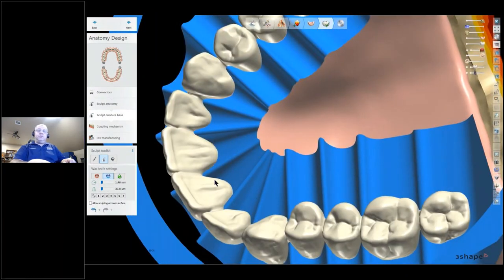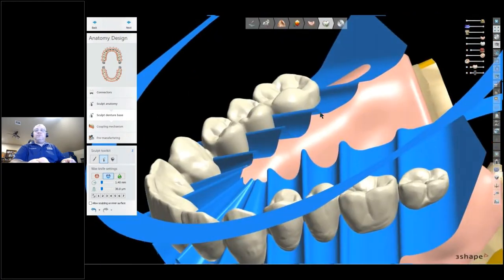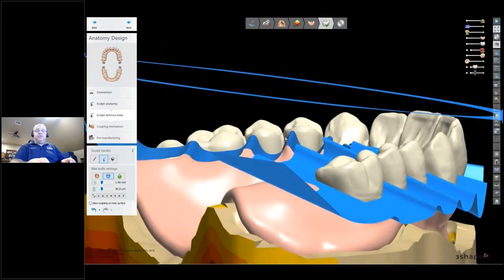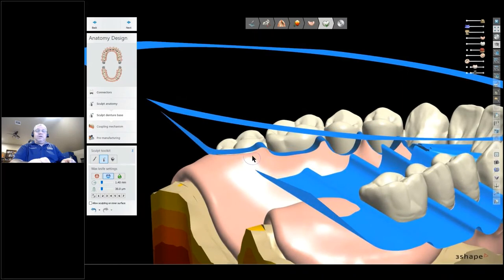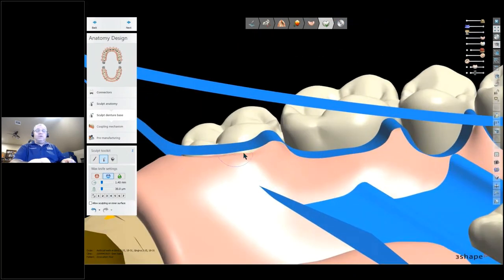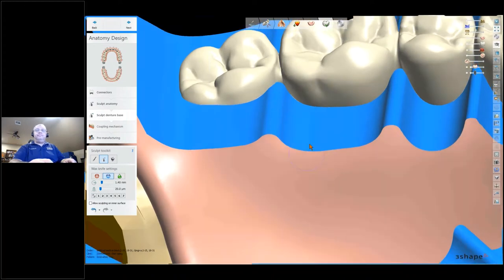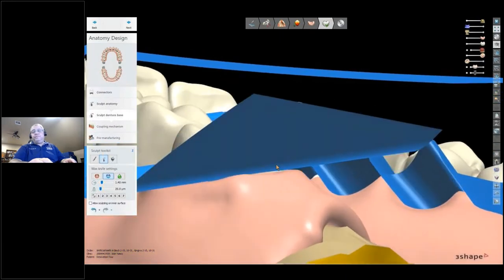Okay, do the same thing everywhere on the lingual, because the lingual's just as important. There we go. I'm going to also look at the linguals to see if I've got any areas. Oh, look here. Here I've got an area where it is white underneath, gingival to the ribbon. And that I know means that that area of the tooth there is going to be pink. And I don't want that. So I'm going to come back through and add just a hair. But do that all the way around. Looks good.